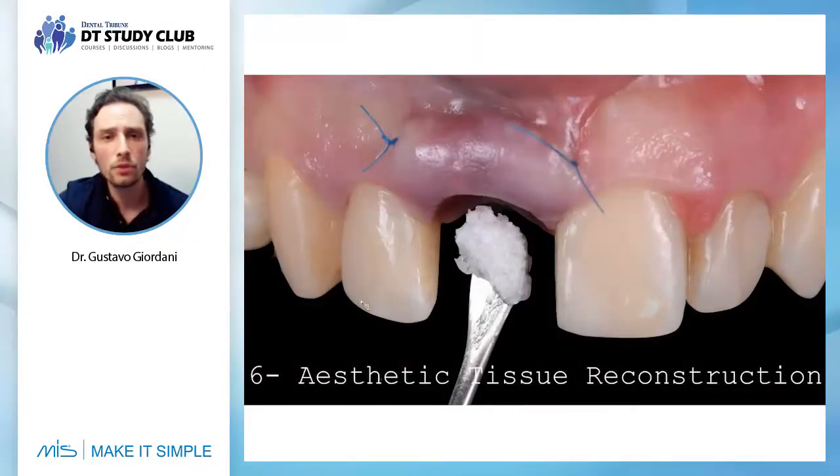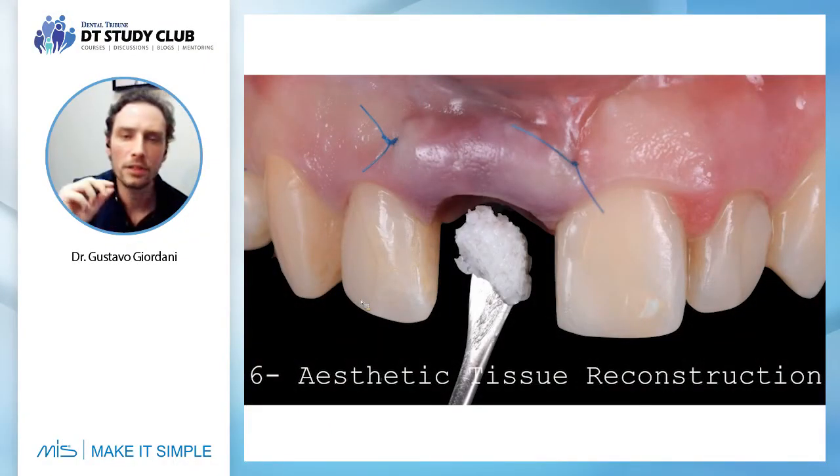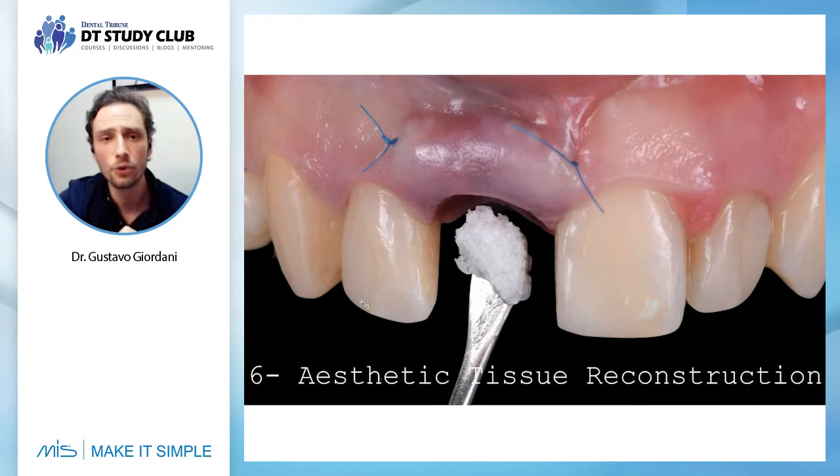So now it's time to move on to step number six, which is the aesthetic tissue reconstruction. This step is very important. And we need to do it in all of our cases.